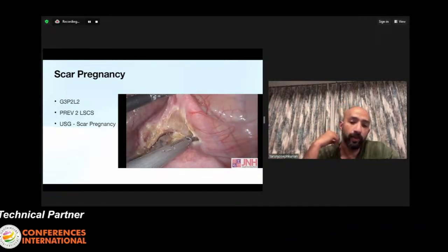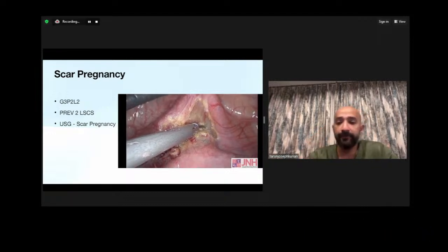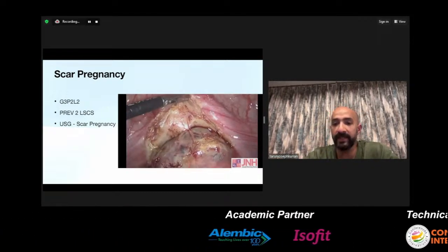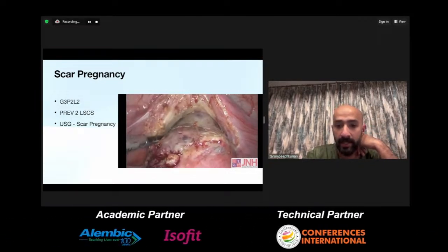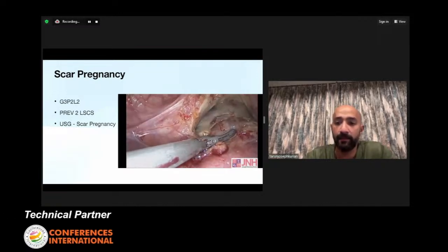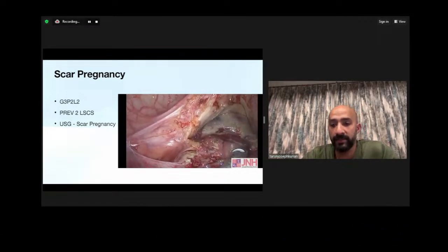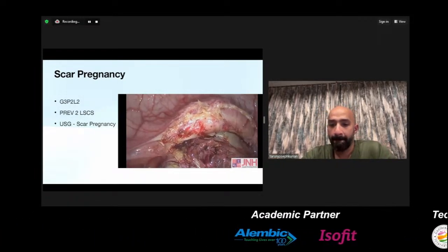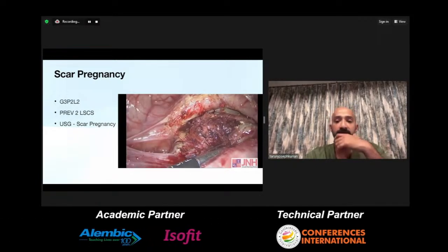So first thing that I did was to dissect off the bladder completely. So we have to get adequate tissue both above and below the scar pregnancy, and only then will we be able to do an adequate repair. So first thing, like I said, making a proper dissection. You can see the nice bulging scar pregnancy there. We made an incision using the harmonic scalpel, cut into it, and then started to excise out the entire mass.